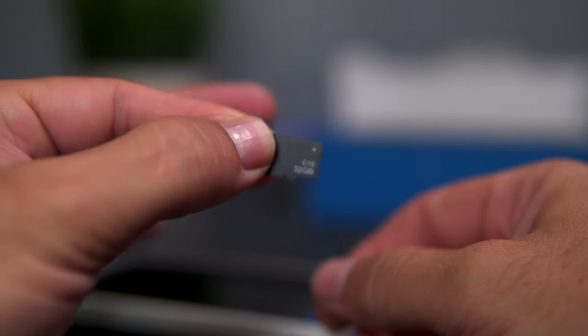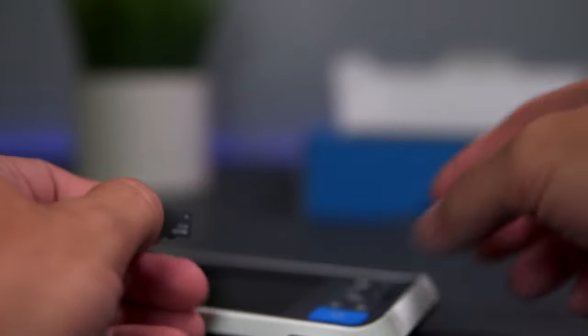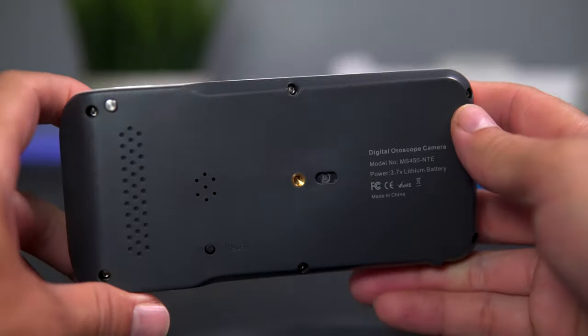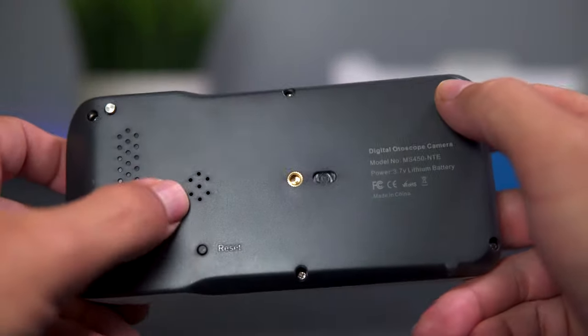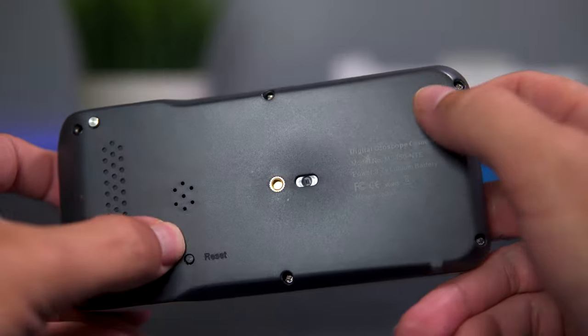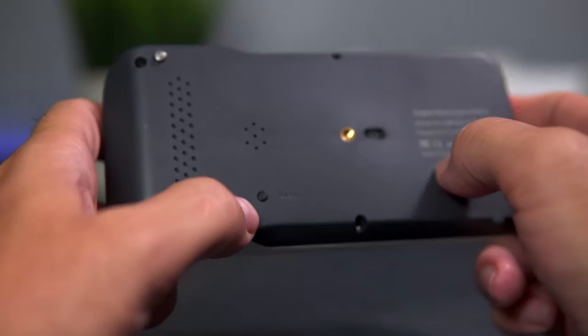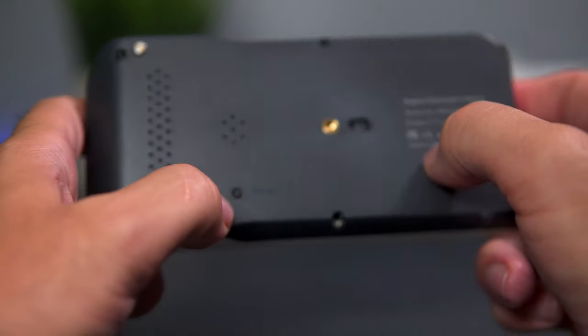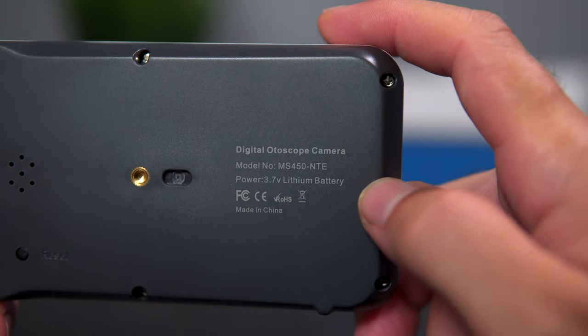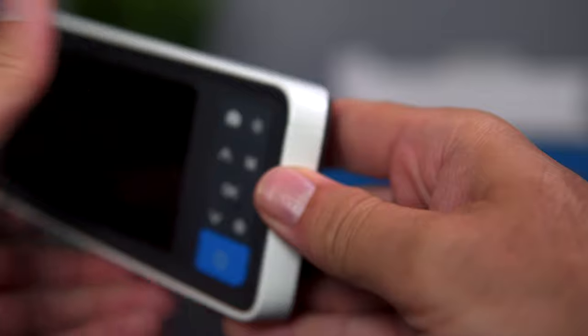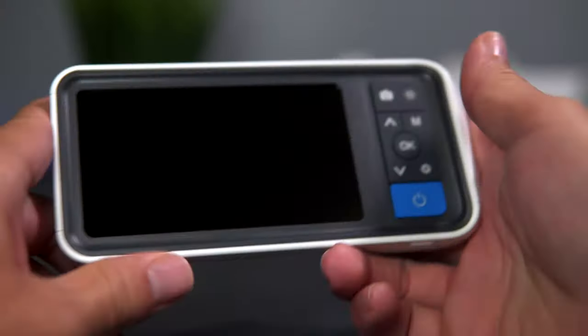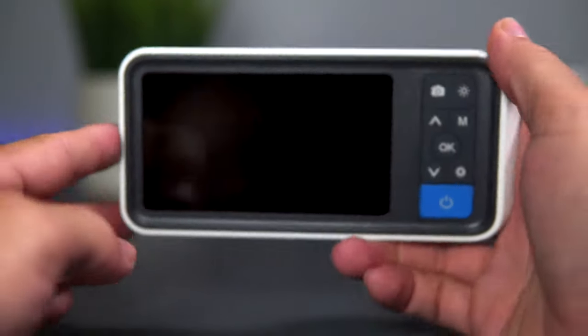Here we have the back—looks like a speaker grill here, a mounting point, a little reset button, and more information about the device. Obviously it is rechargeable, which is very nice because it's portable.